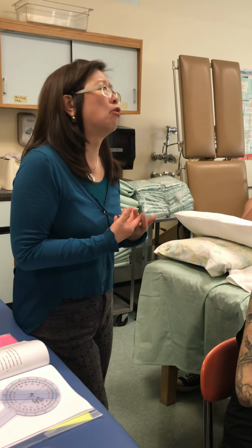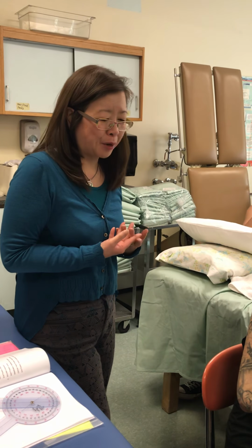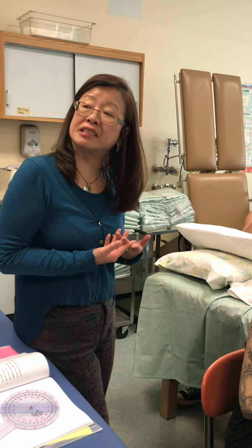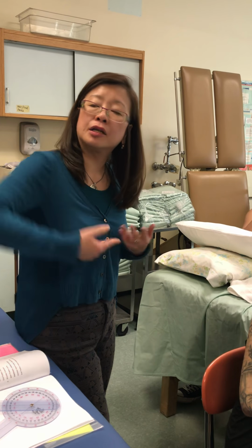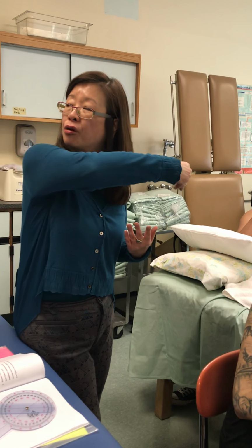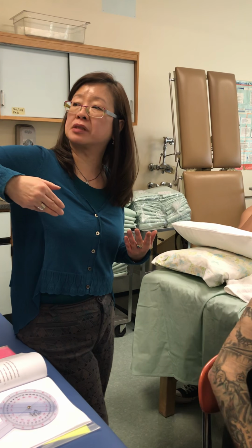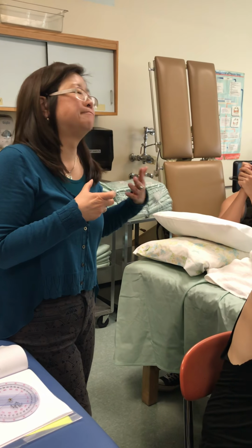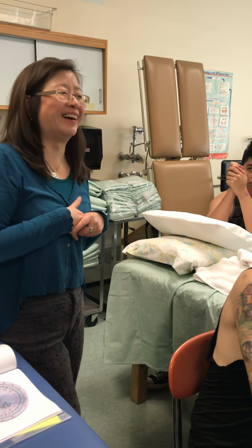Because you're going to say, okay, if they have 100 something odd degrees of shoulder horizontal adduction, you're most likely going to know that they started off in an abductor position instead of a flex position. Does that sort of make sense to you? So how would you document that, if they're starting like that? You're just going to have to go with it, unfortunately.